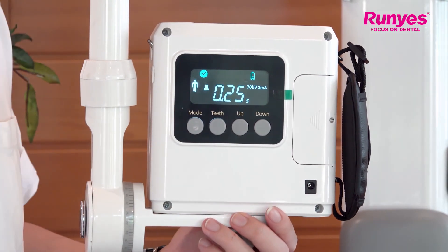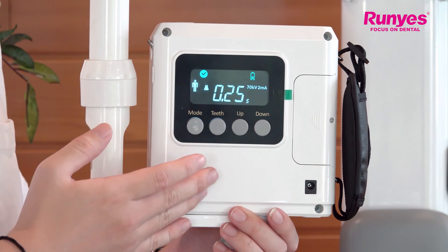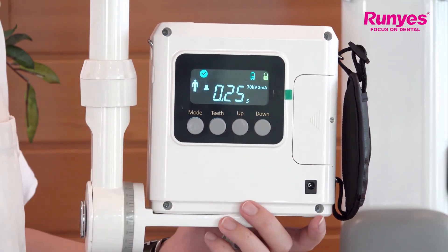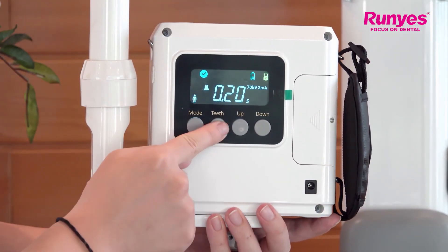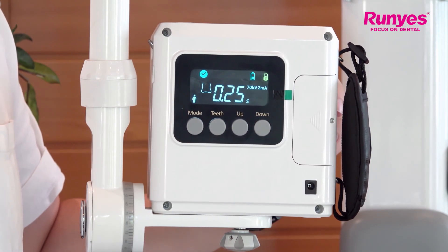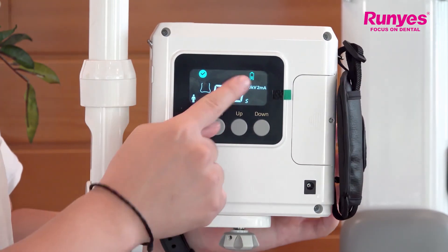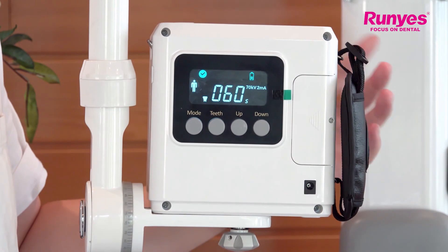Next, I will show you how to lock the device. The reason we lock it is because sometimes during an exhibition, or when we don't want to misoperate the portable x-ray, we can press the mode key and the teeth key together once. The small lock icon shows up in the display, which means the device has been locked. You can still select the mode, select the teeth, and adjust the exposure time, but you cannot expose. If you press the exposure key, it will beep twice, meaning the device cannot be exposed because it's locked. To unlock, press the mode and teeth key together again — the lock icon will disappear and the device is unlocked.